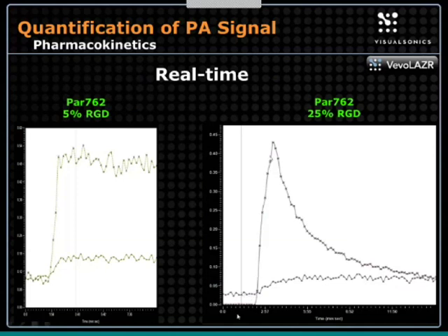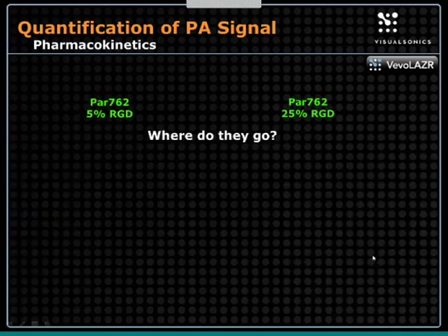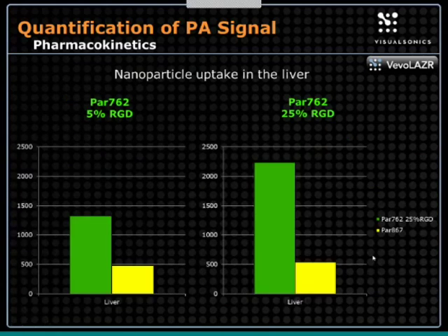It's going in, we see a huge perfusion, but the immune system is recognizing this particle way more than it's recognizing this one, and therefore it's coming out of the circulation and indeed going into the liver. So really, really neat results here and a very, very powerful technique. So now you can appreciate that if you're developing these particles, there's going to be a balance here between how much targeting you have and how long these things are going to stay in the circulation.